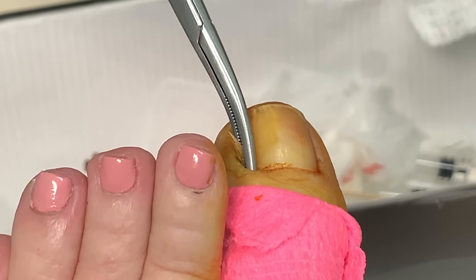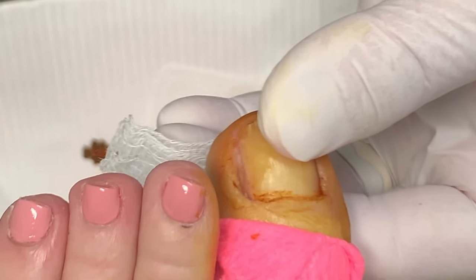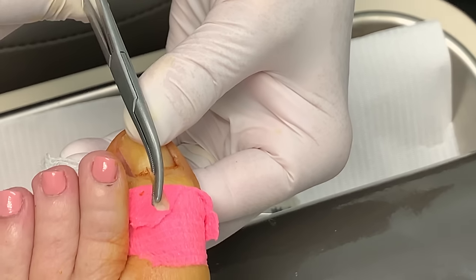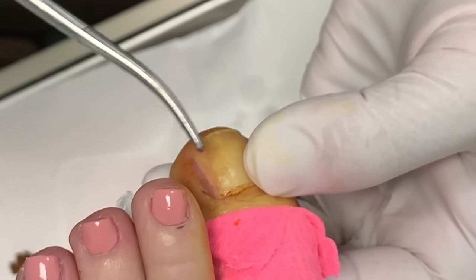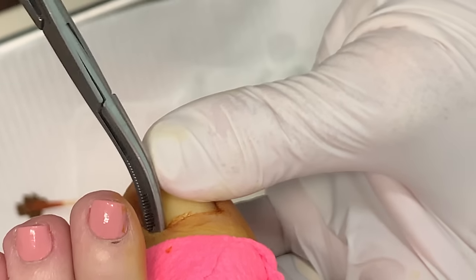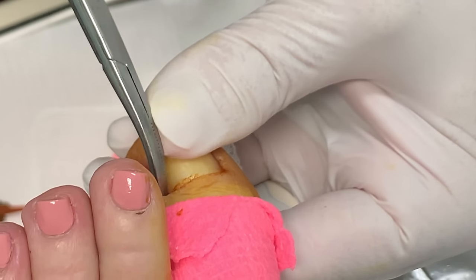The first sensation you lose is vibratory sensation and sharp and dull. But your proprioceptive sensation is sometimes still there — that's feeling where your toe is in space and feeling pressure sensations. That's what they feel and they think they're feeling pain. So I've got a hold of this nail. We're going to twist. And there it is right there. See the bottom part, how it flares out — not as impressive as the last one, but it's definitely a big piece of nail. We're going to see what's left in the side here because it's a little bit swollen.